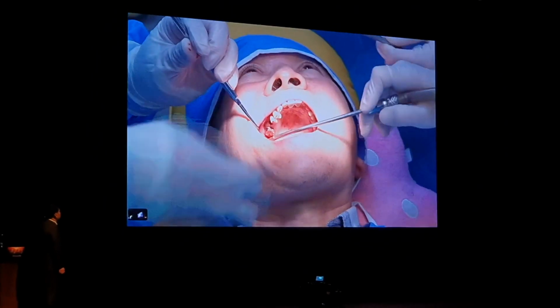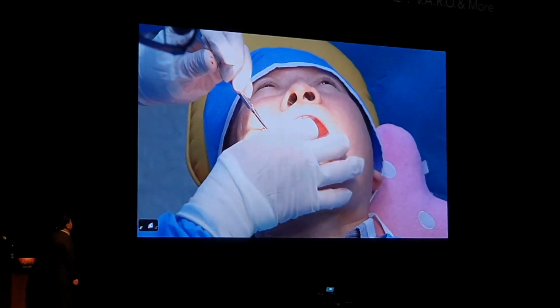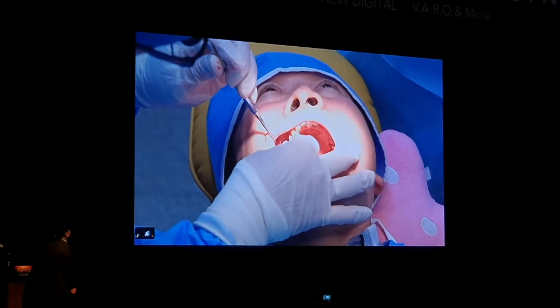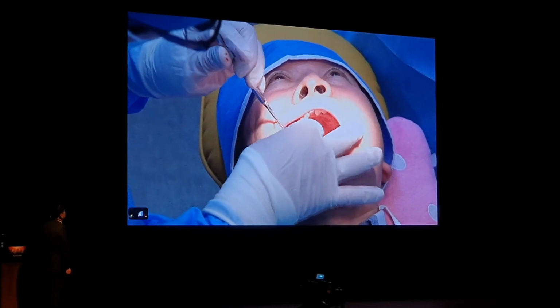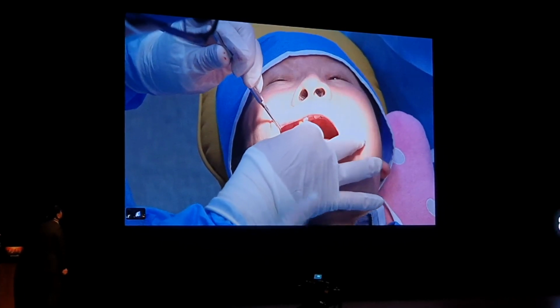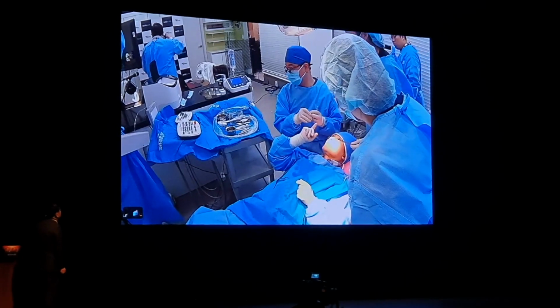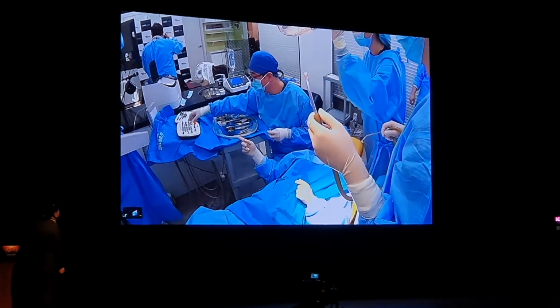Alright, at this moment. So Dr. Kim, after you use a wrench, tell us what the initial stability values look like. I will. Hold on, I think it's a different one. Isn't this for the IT type? Yes, it seems so.